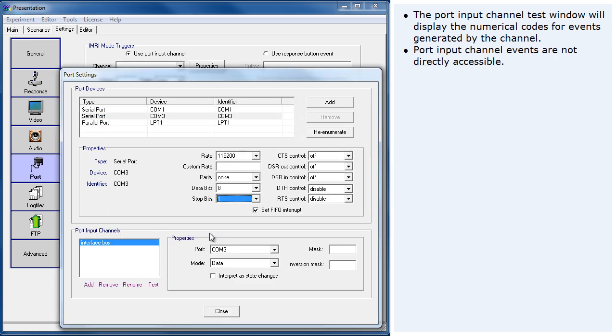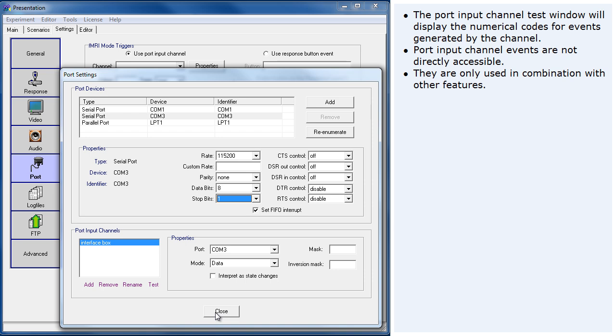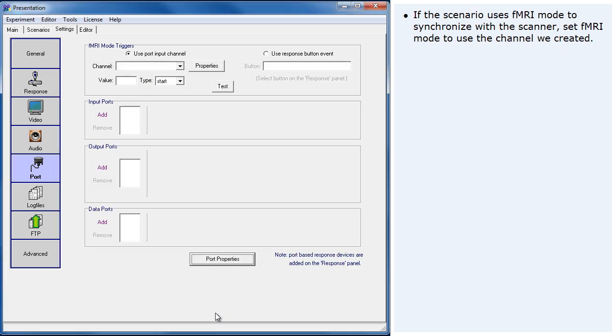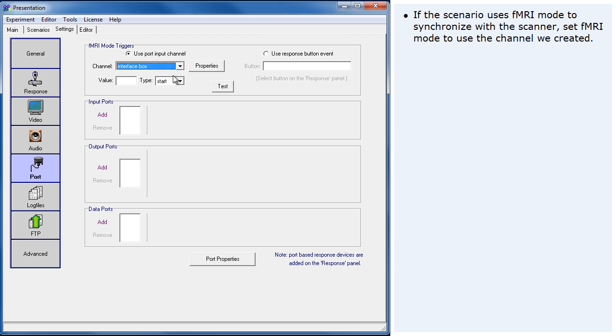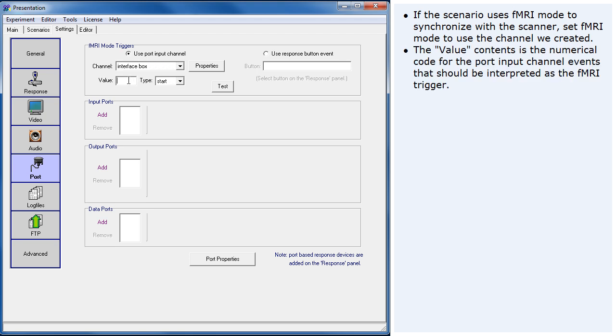Port input channel events are not directly accessible. They are only used in combination with other features. If the scenario uses fMRI mode to synchronize with the scanner, set fMRI mode to use the channel we created. The value contents is the numerical code for the port input channel events that should be interpreted as the fMRI trigger.